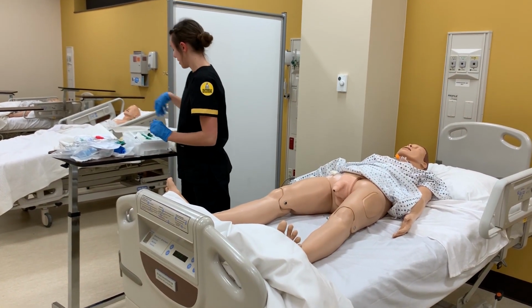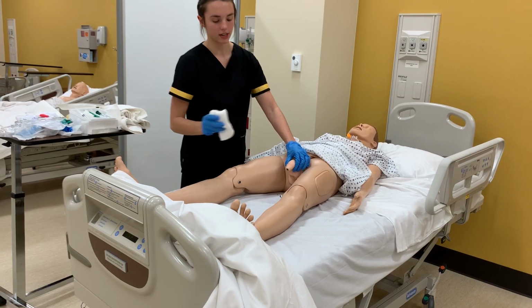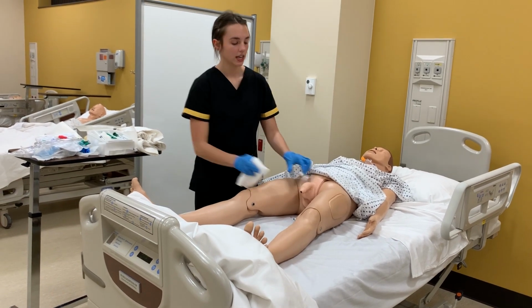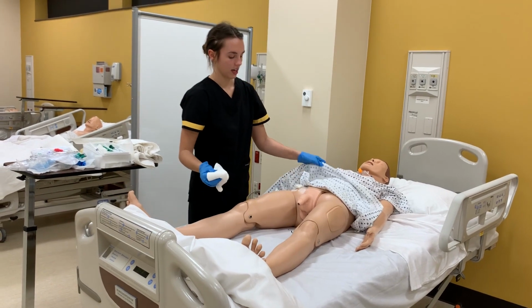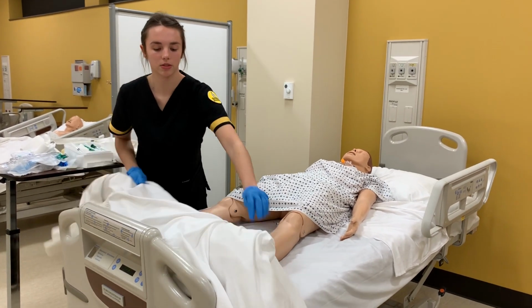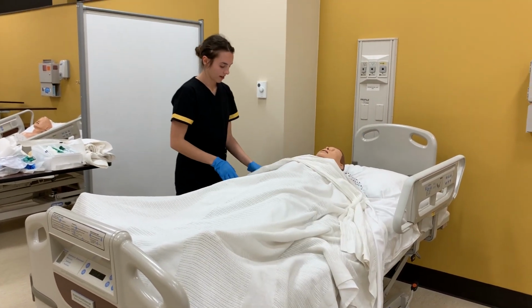So now, just to clean you up in case anything got on you, we would just clean with warm water around, and one more time, get a clean section and go down. There we go. And after removing the catheter, they should be able to void within an 8-hour period, so we would let the doctor know if not. And everything is all good.